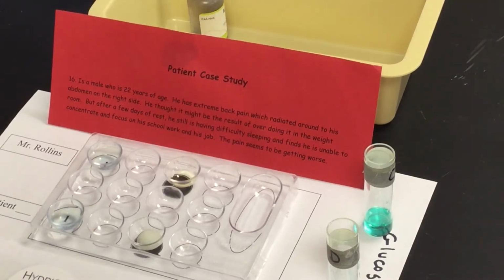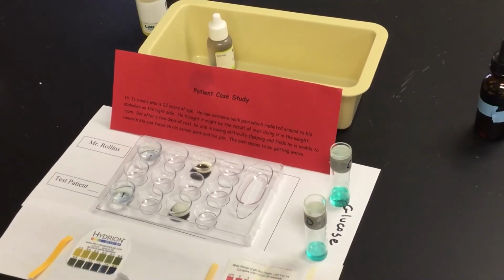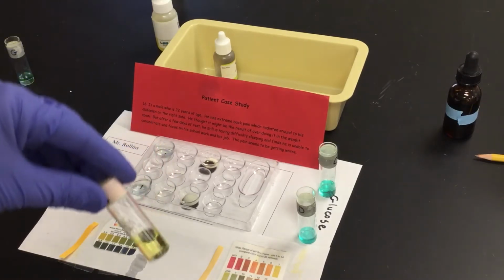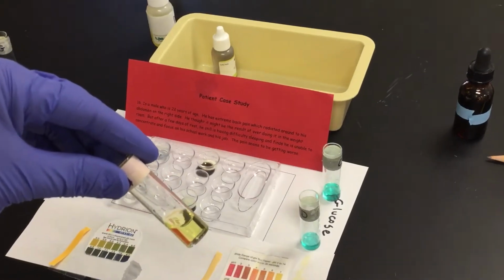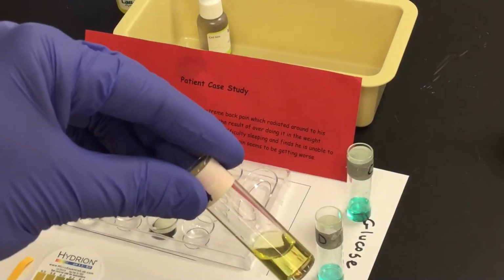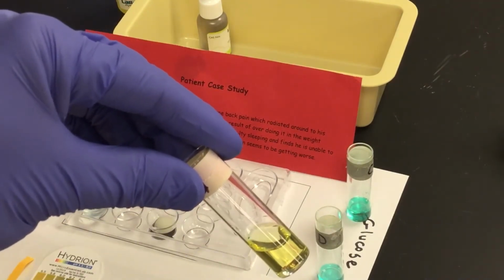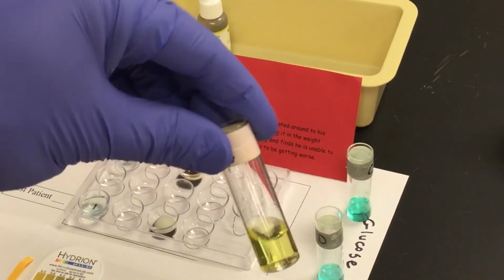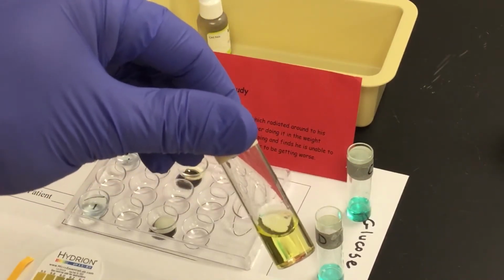As we go through and start looking at patient number 16, first off, his sample of urine. His sample of urine in the test tube is going to look like this. I'm trying to give you guys a clear view here. So that's the sample for patient number 16. You want to mark down your color. Try to be as exact as possible.